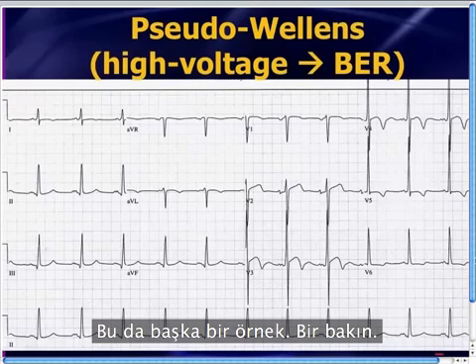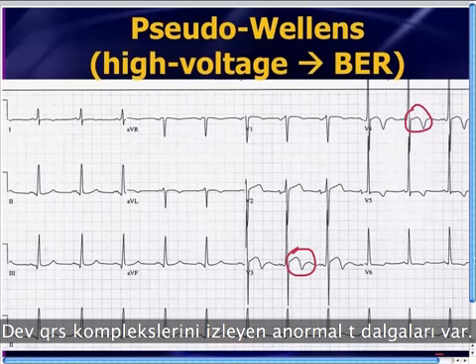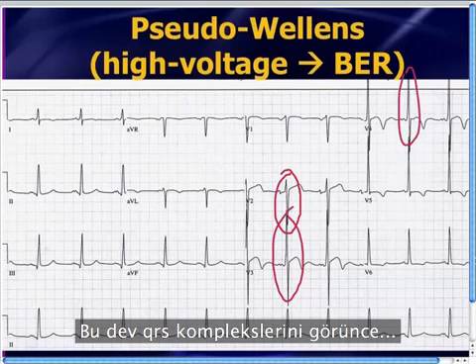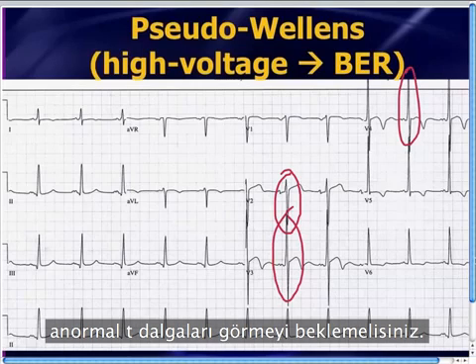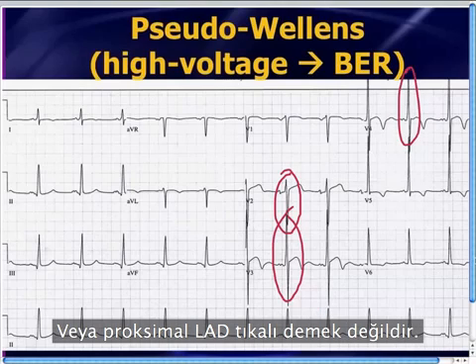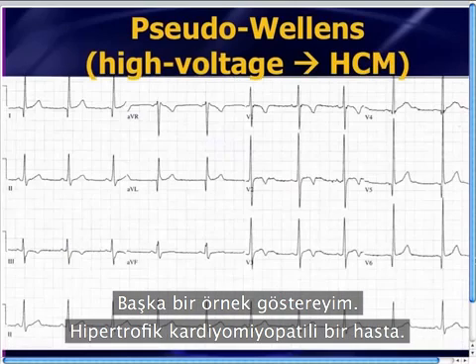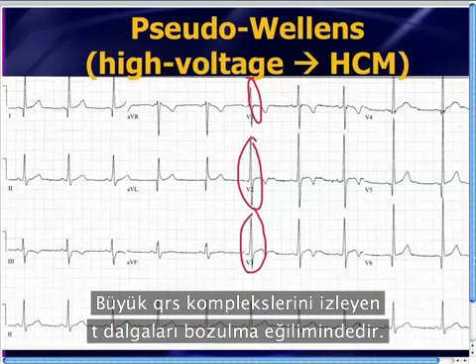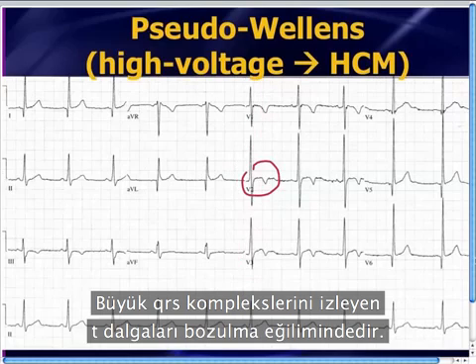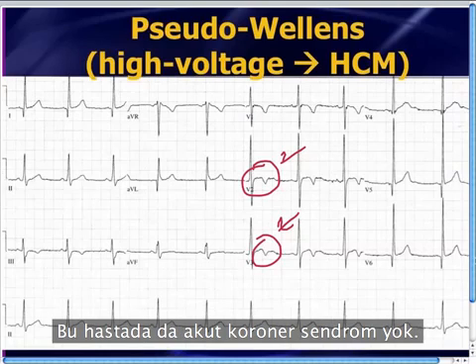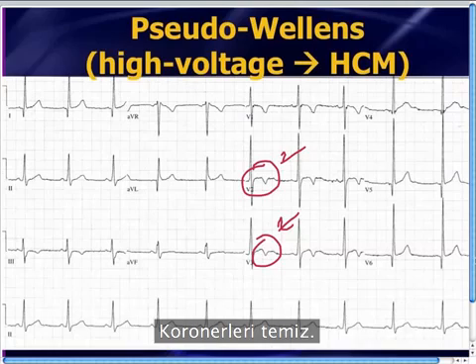Here's another example — there are abnormal-looking T-waves following giant QRS complexes. When you see these giant QRS complexes, you should expect to see abnormal T-waves. This is not specific and does not mean the patient has Wellens or a proximal LAD occlusion. Here's a patient with hypertrophic cardiomyopathy. HCM gives you very large QRS complexes, and when you have very large QRS complexes, the subsequent T-waves tend to be very messed up — in this case they're biphasic. This patient also has clean coronaries and is not suffering from ACS. Those biphasic T-waves mean nothing.